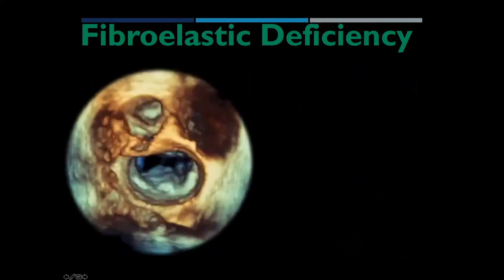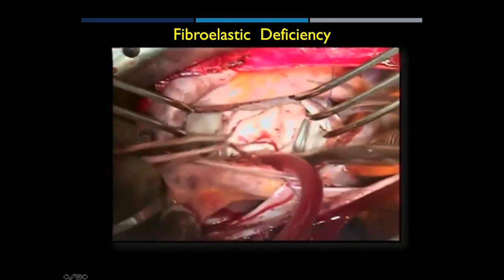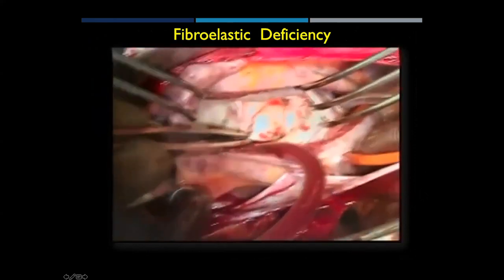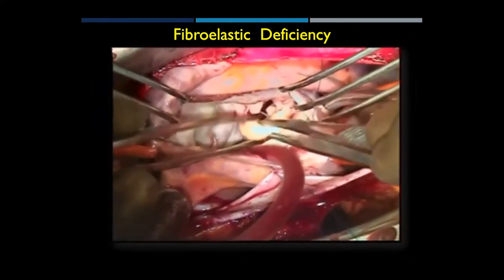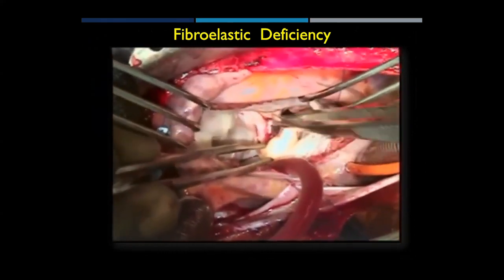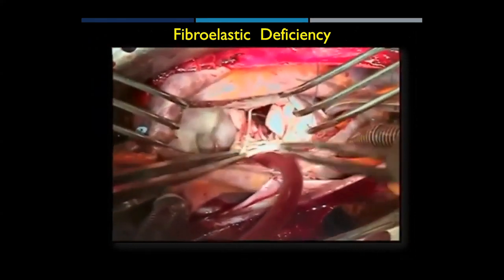This is the 3D. And if you look intraoperatively, you can appreciate the surgeon here is going to show us the pathology. In this same patient, the surgeon is taking out that P2 scallop, and you can appreciate those are the ruptured cords. There are actually two of them there.